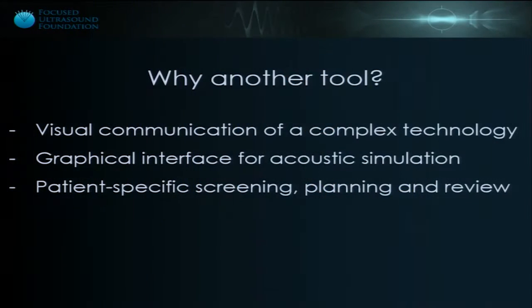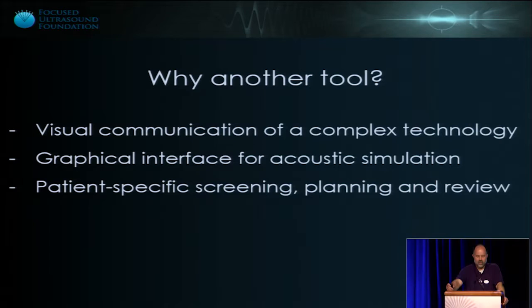There are certainly lots of visualization tools out there, but these are our three leading reasons to do this. One is that we need to communicate the complexities of this technology to a lay audience oftentimes, and having something to show that's interactive and visual is better than a complicated explanation. We also intend to use this ultimately as the interface to several groups that are pursuing full acoustic simulations, for specifying targets and geometry. And then ultimately this may grow up into a patient-specific screening, planning, and review tool.